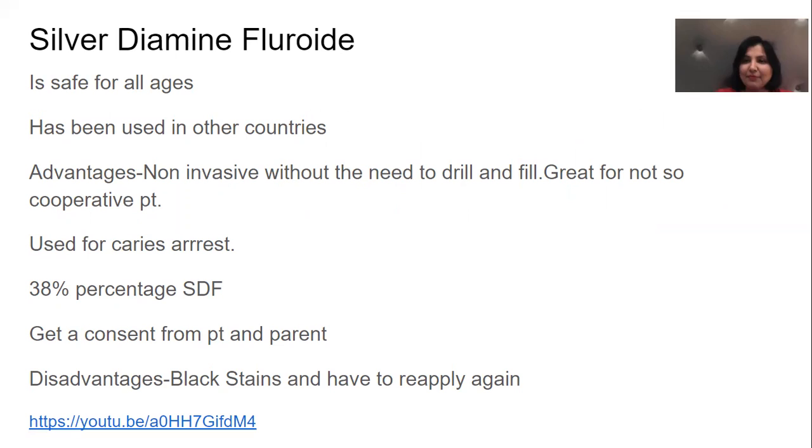So, okay. Silver diamine fluoride. It has been done in various parts of the world for a long time, but in the US it got approved now and we are doing it. It's safe in all ages.